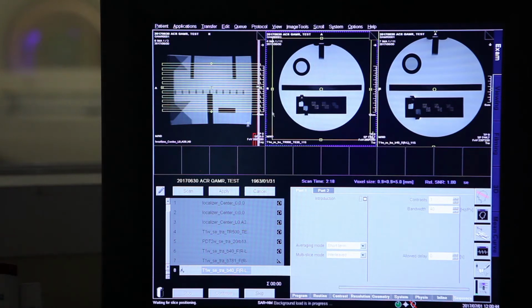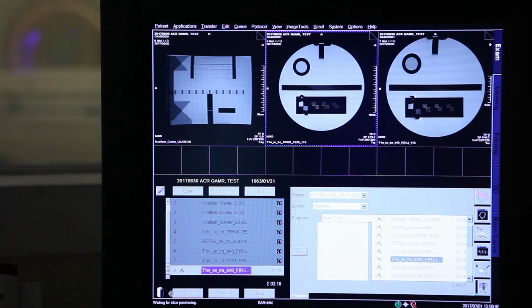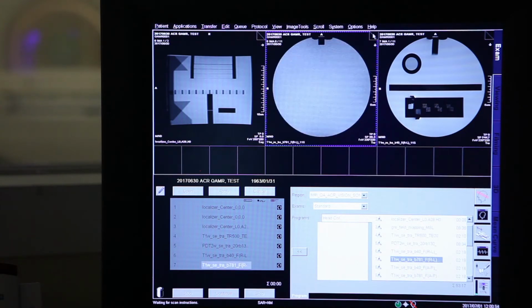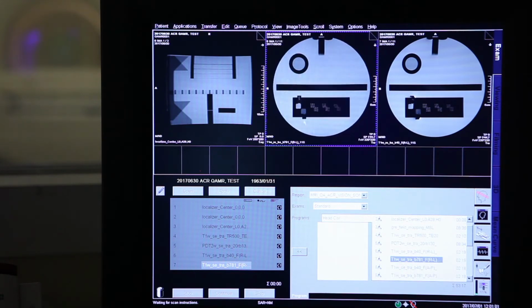Can you have it there? I think we have the new images finished. Now we have the new images. Let's go and check this. In these new images, I'm going to put it here, and you're going to see the same slides. What to mention here? Okay, that's a good idea. There it is.